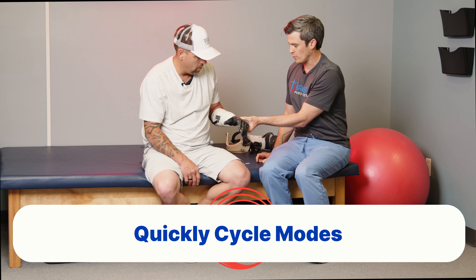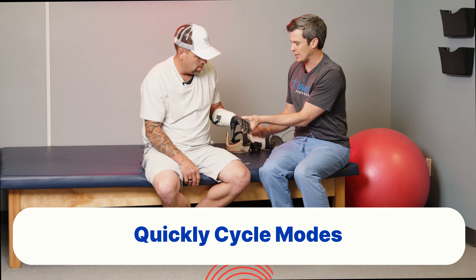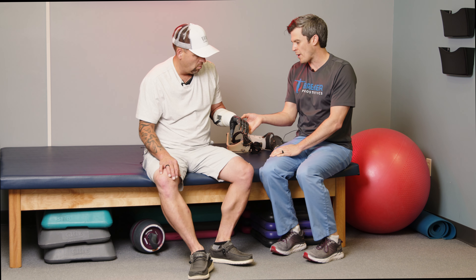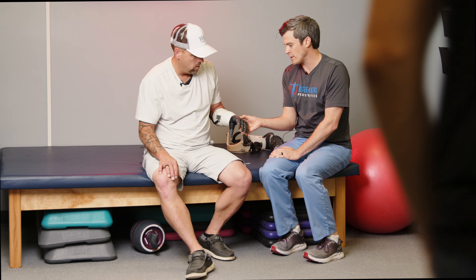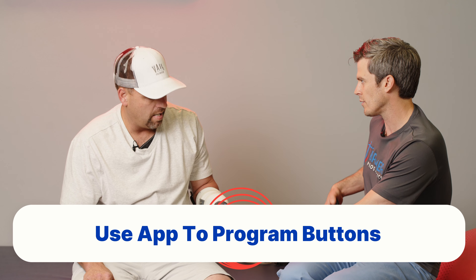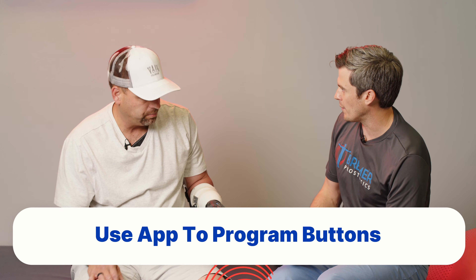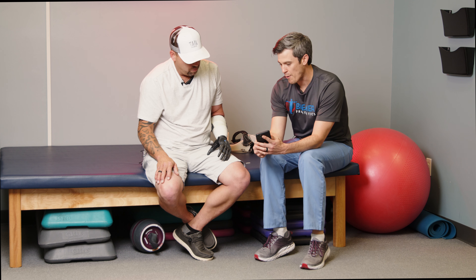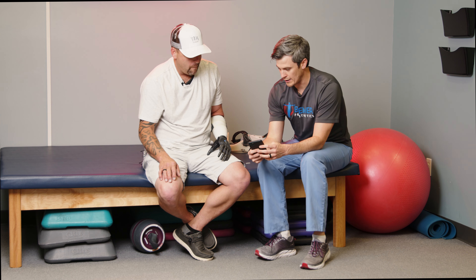What these will do is they'll cycle the mode for you. Each one of them does its own different thing. This home button always has the same ones. These two buttons you can use an app to program what grips it's going to do based on you cycling through. So the app also works to switch the modes.